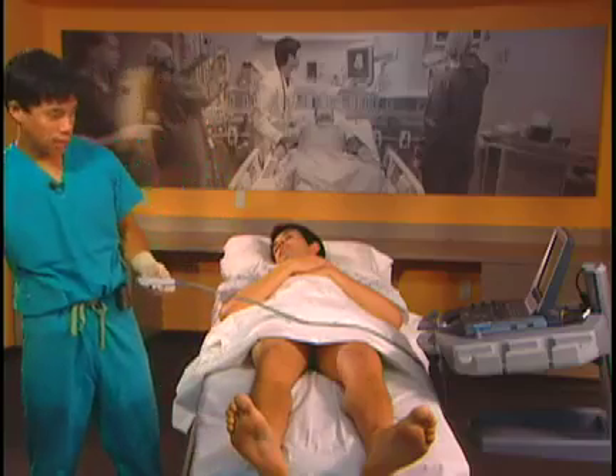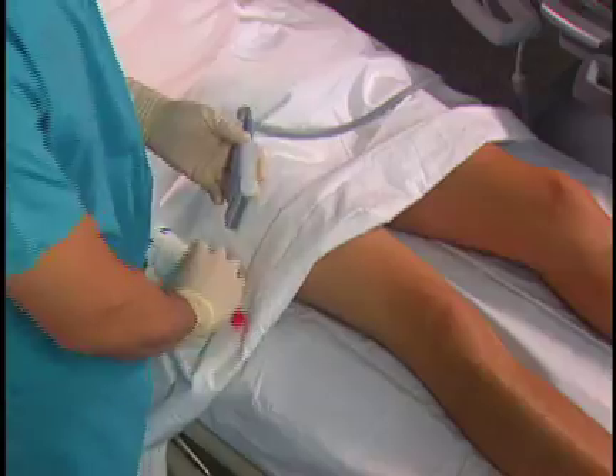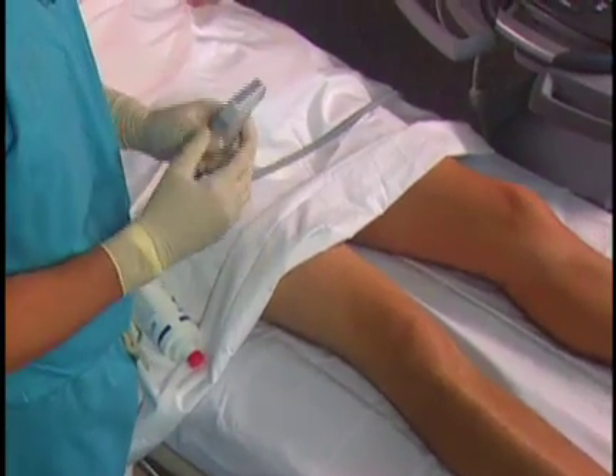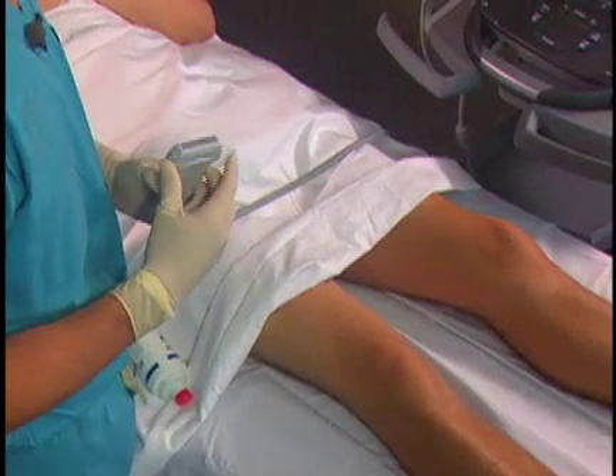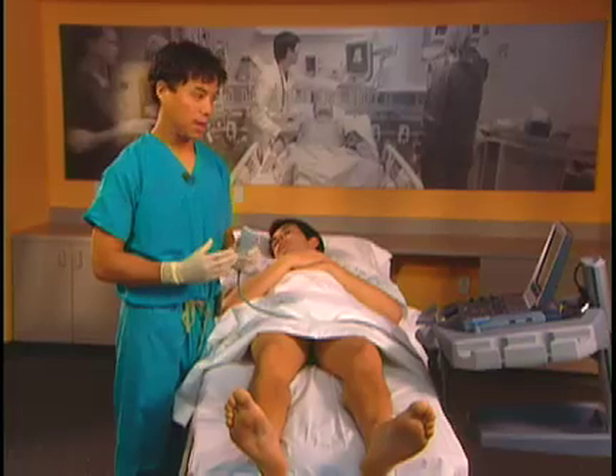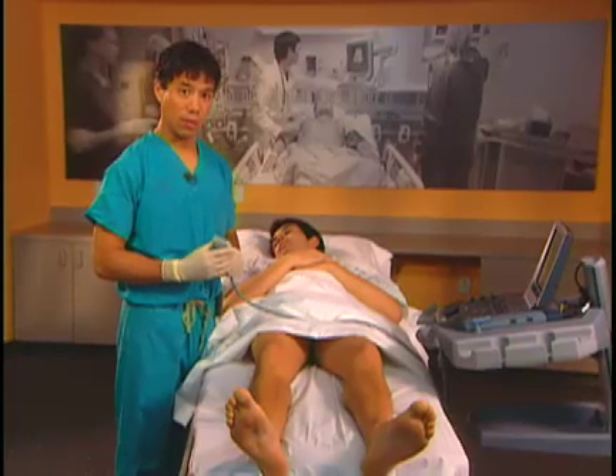To perform the Saphenous Nerve Block, we typically use a linear probe. The linear probe allows us to get good resolution and reasonable penetration. Typical settings start between 4 and 6 cm total depth, expecting the nerve to be between 2 and 4 cm.